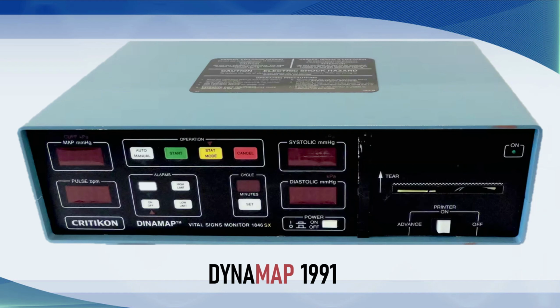And the main measurement that the Dynamap made was the mean arterial pressure. And that's why the MAP is over there on the left-hand side as the big number. And scooted across on the middle right-hand side is the systolic and diastolic blood pressure. And I'll explain to you now why that is the case.